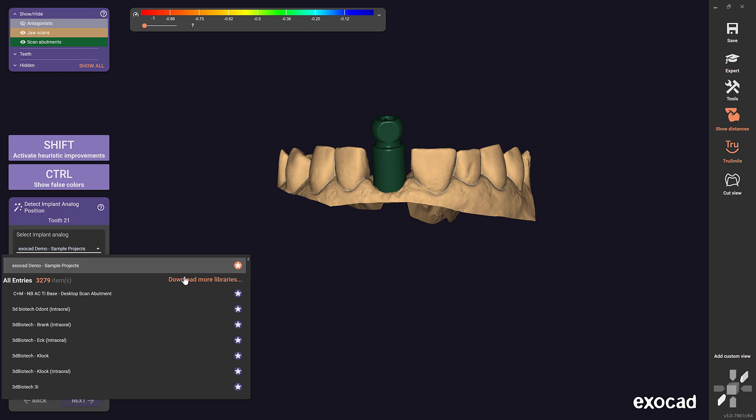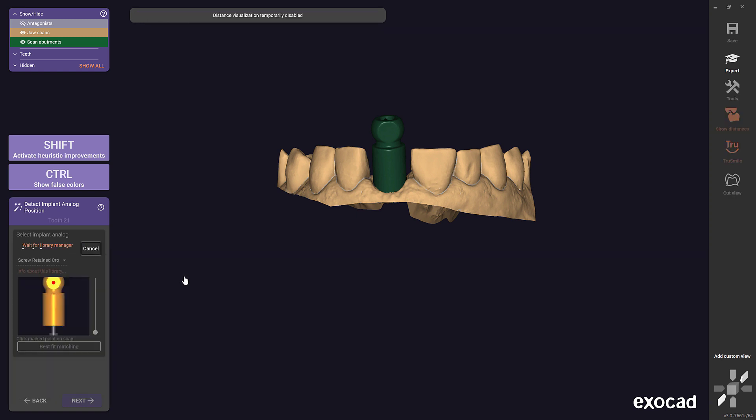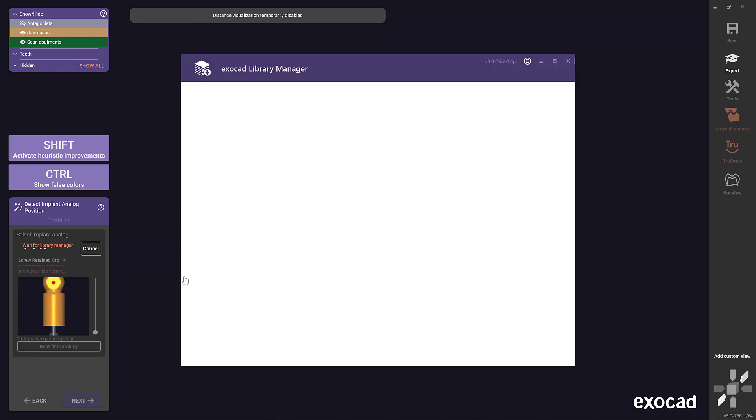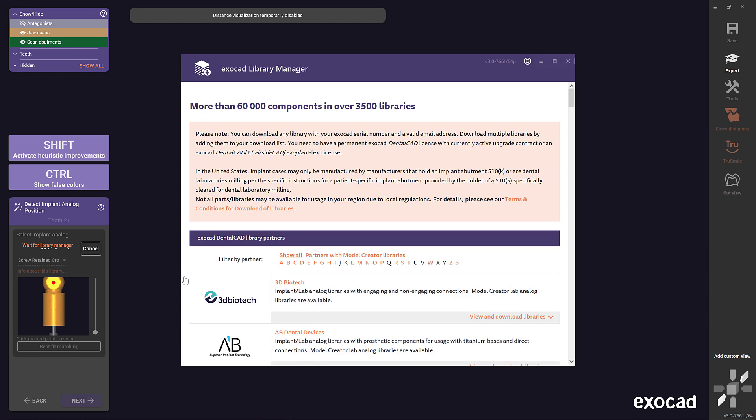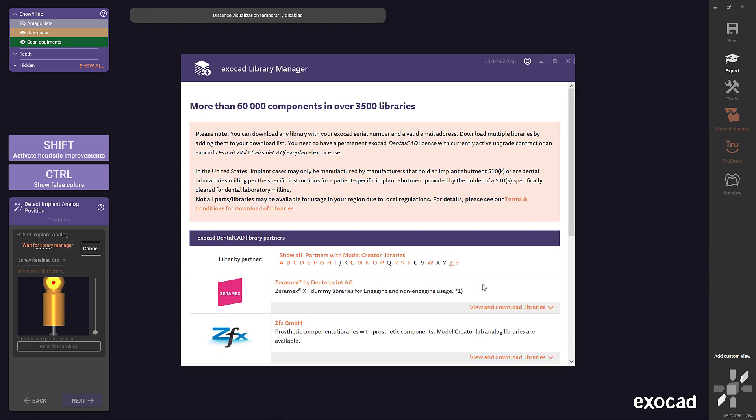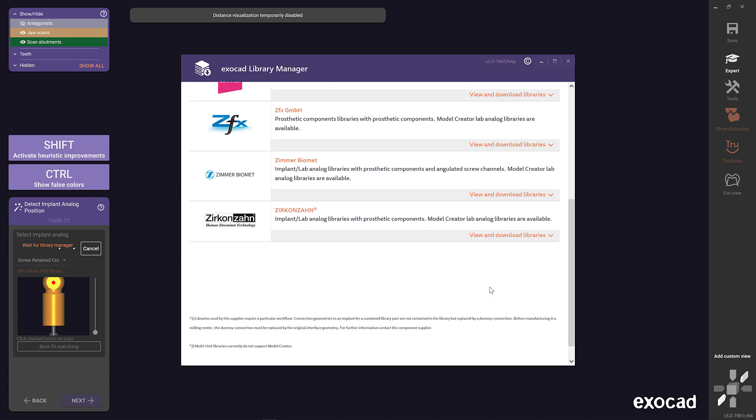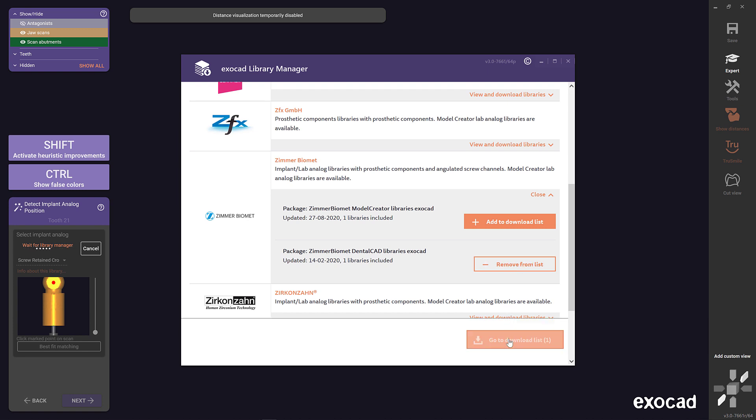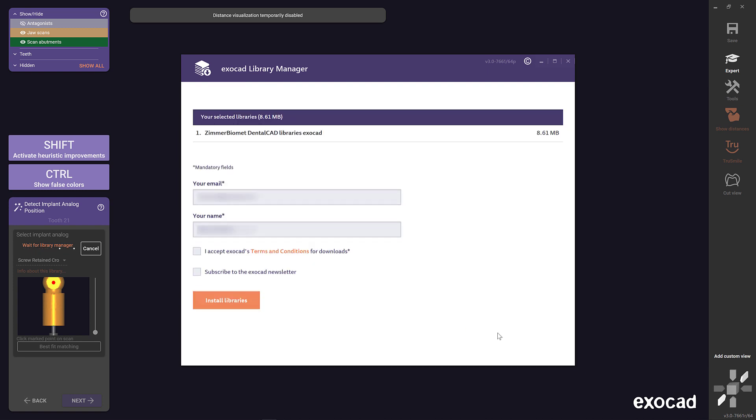After starting the library manager, the desired libraries are selected directly within CAD. All selected libraries are automatically downloaded, stored in the corresponding folder, and installed. Please enter your email and name and accept the ExoCAD terms and conditions.